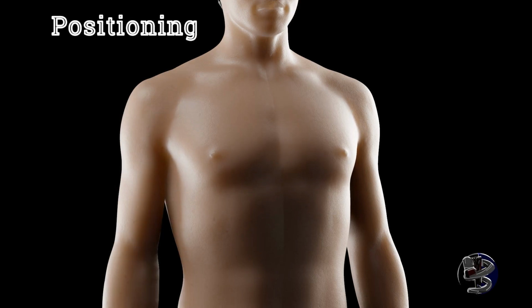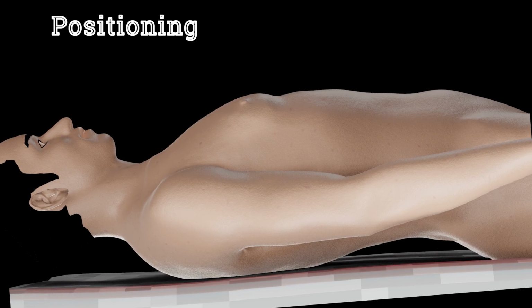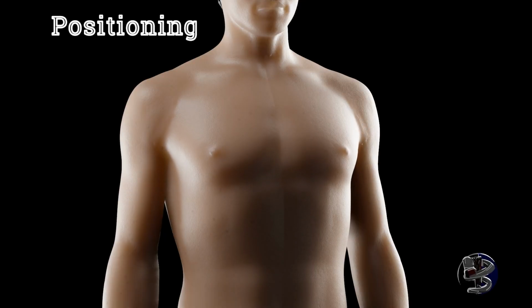Patient positioning. The exam is typically performed in the supine position. However, the Trendelenburg position may enhance detection of free fluid in the right upper quadrant view by moving fluid up from the paracolic gutters. The same occurs, although to a lesser extent, in the left upper quadrant.